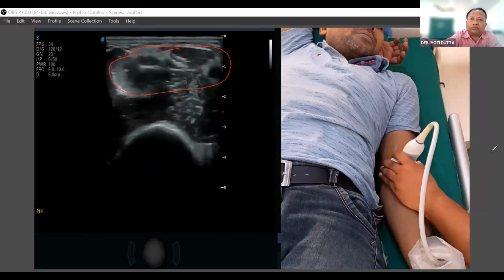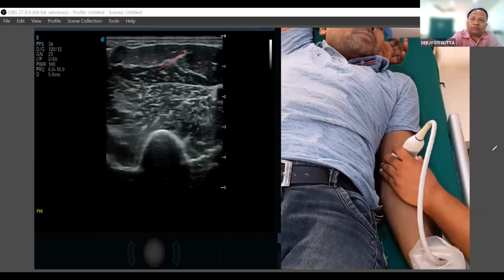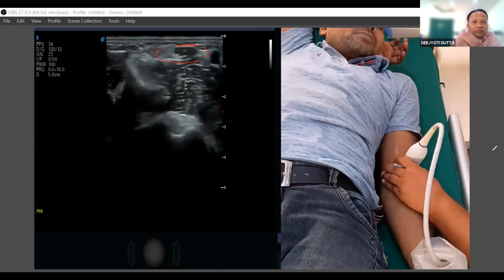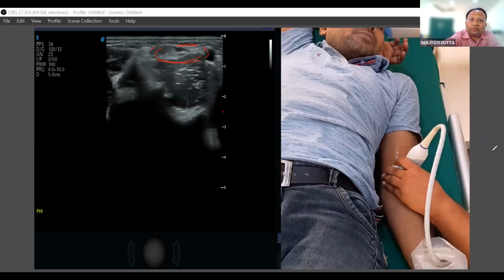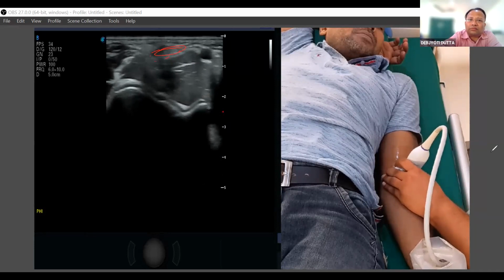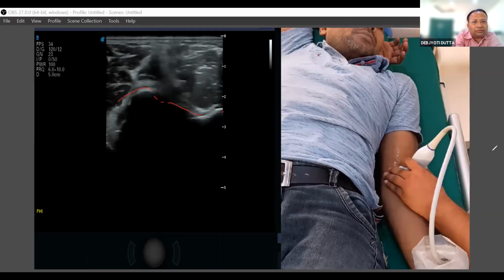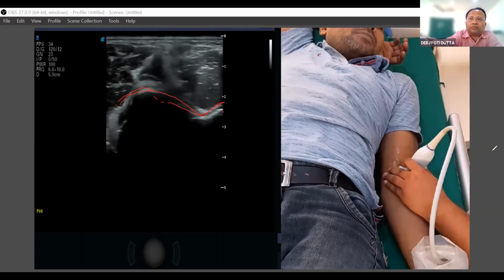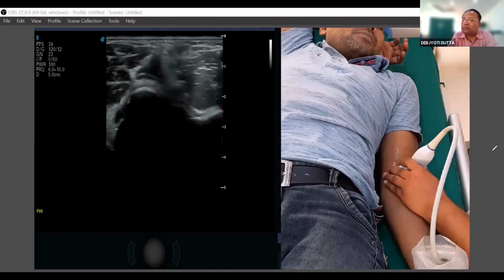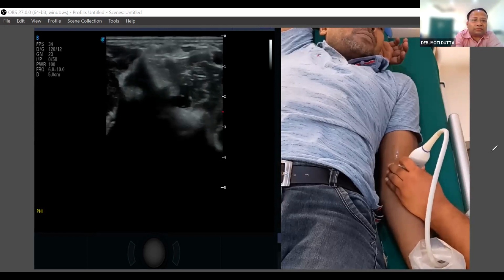Can you see the biceps, the upper part? Here, you can see almost 50% biceps and 50% brachialis. As we are coming down, biceps is becoming narrowed to only a tendon. And when we are coming down, we are able to see this curvilinear margin of the lower part of the humerus. Now, the left part of the screen, what I am showing, is the lateral part of the patient, or lateral part of the elbow.